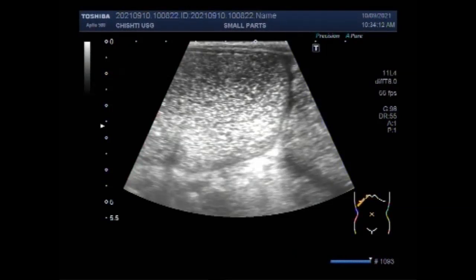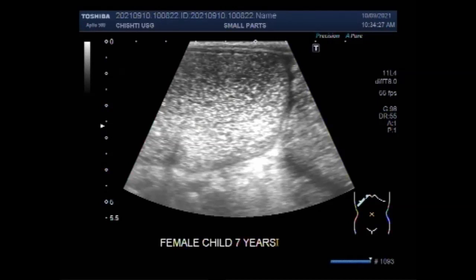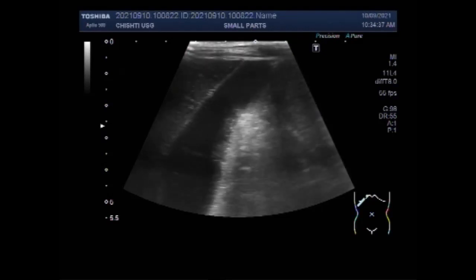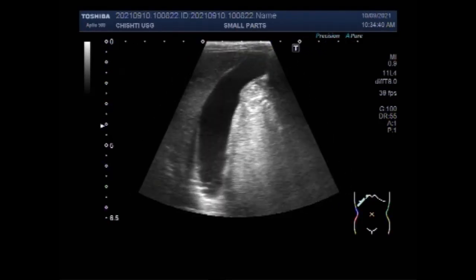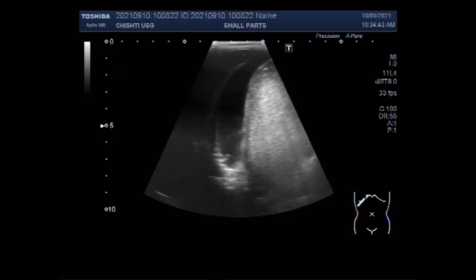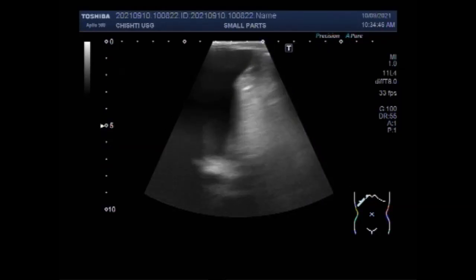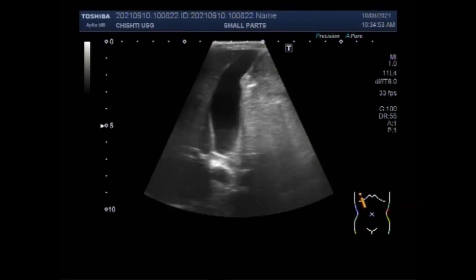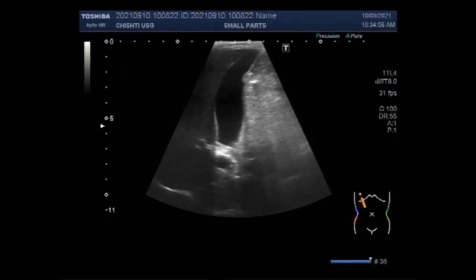This ultrasound video shows a case of intestinal obstruction. The patient is a female child aged about seven years. You can see the distended gut loops. In patients with small bowel obstruction, the supine view shows dilatation of multiple loops of small bowel with paucity of air in the large bowel. You can see the gallbladder and the liver. These findings, in conjunction with lack of air and stool in the distal colon and rectum, are highly suggestive of mechanical intestinal obstruction.